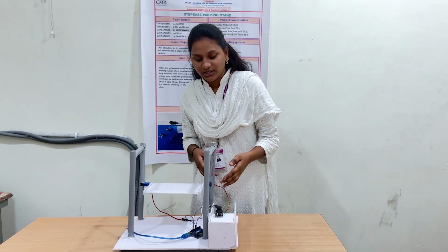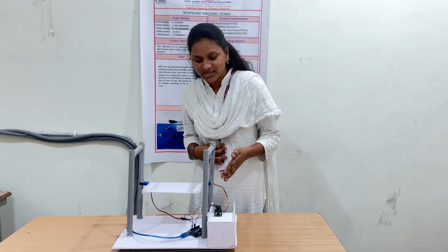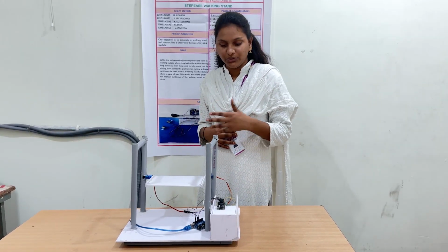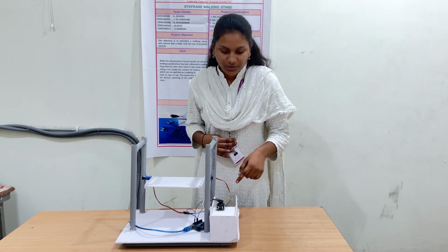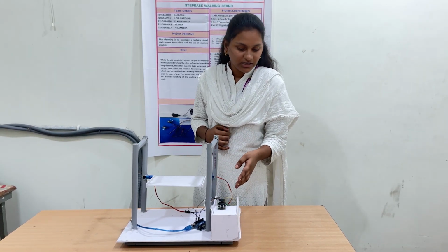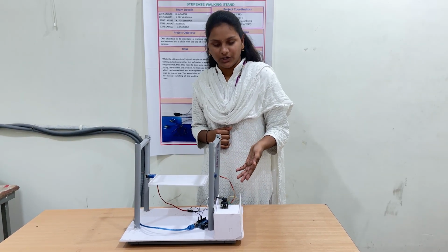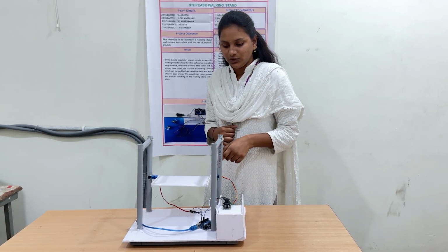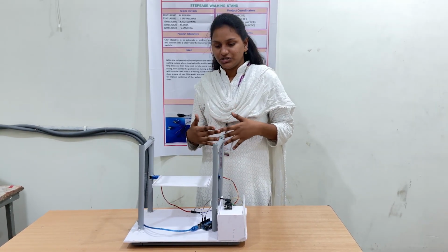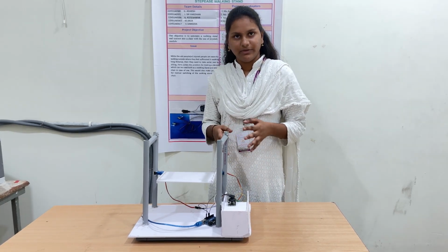And here we used Arduino UNO, and it has 14 digital pins and 6 analog pins, and it has a USB connection to transfer data from laptop to Arduino. And we used a joystick. It has a handle and it has 4 pins, and with the handle the movement of the input can be controlled. So here we use a joystick to control the motion of the seat, and here we use a breadboard to give the connections of jumper wires.